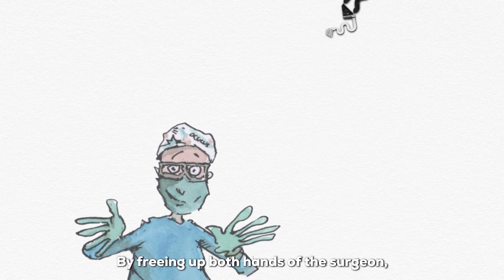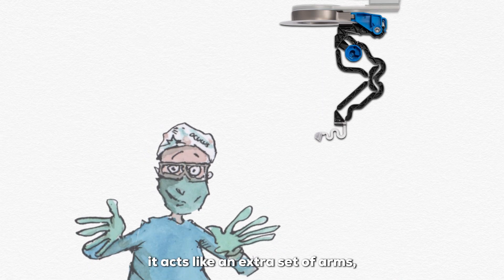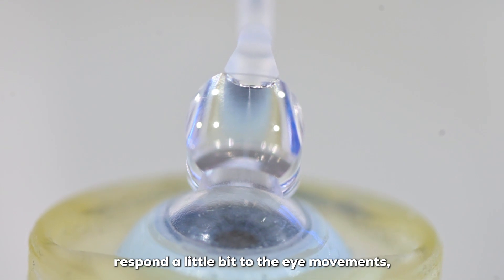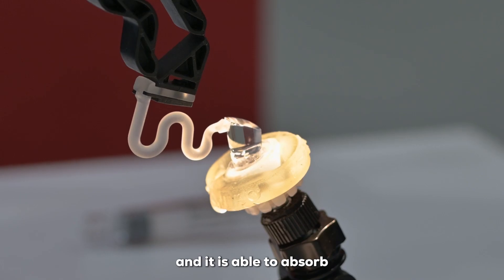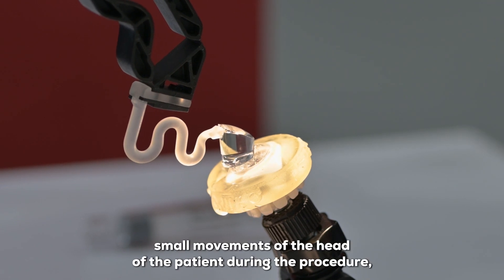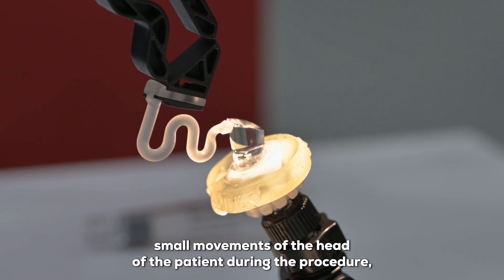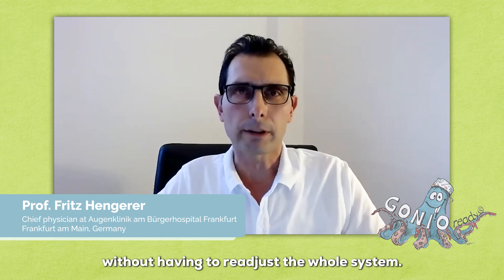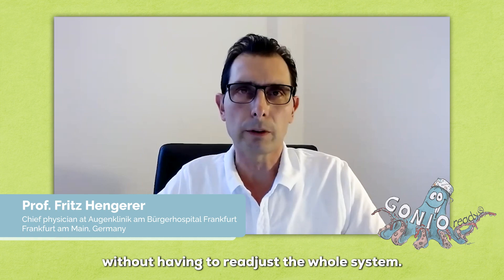By freeing up both hands of the surgeon, it acts like an extra set of arms — much like an octopus with its eight limbs. The FLEX system responds to eye movements and absorbs some of the pressure forces and small movements of the patient's head during the procedure, providing the surgeon with a stable situation without having to readjust the whole system.